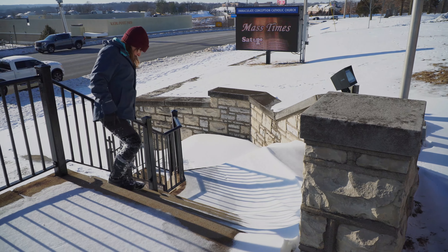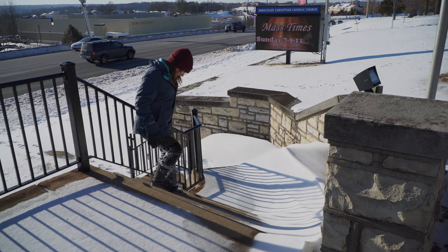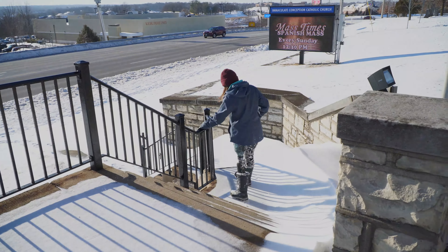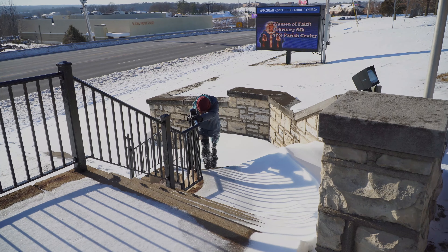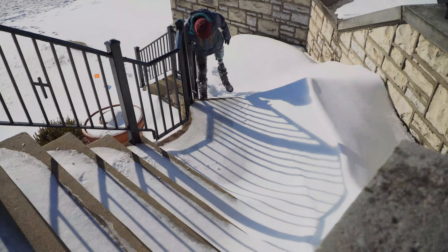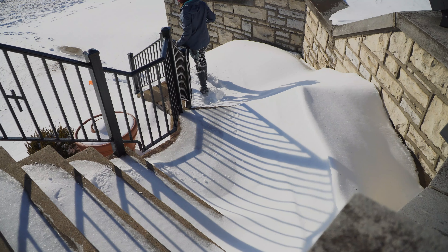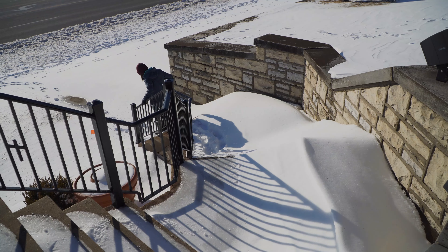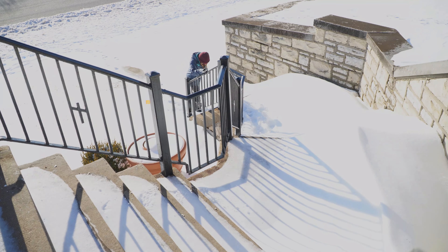Obviously, once the snow gets so thick, this leg is pretty useless. I don't even know what's down there — it could be like gophers under this snow and I wouldn't even know it. Can't pick up my leg. It's gonna take me like 20 minutes to walk to the end of the thing.